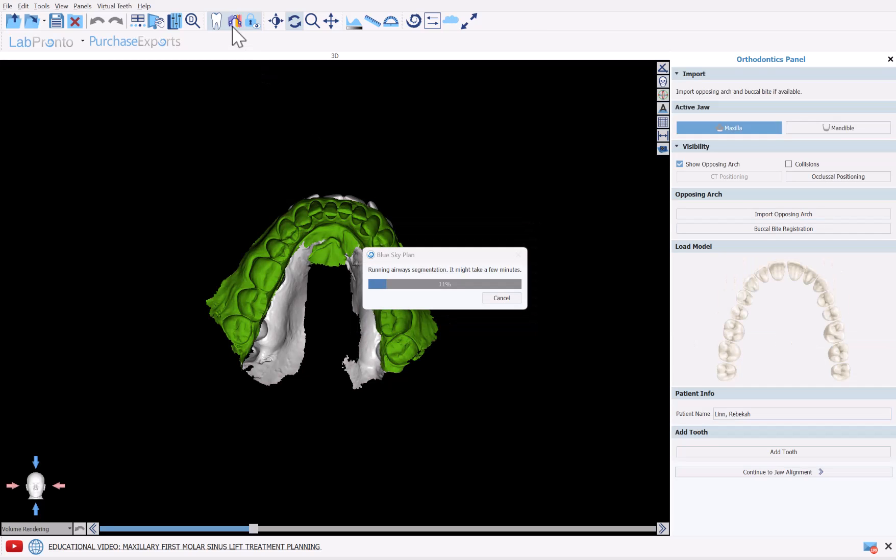The software is now running through some automated processes. We can see it is now running airway segmentation. In order to save time during this video, I will pause the recording when the processing might take a few minutes. The completely automatic segmentations, such as airways, teeth, and bone, do take one or more minutes to run.